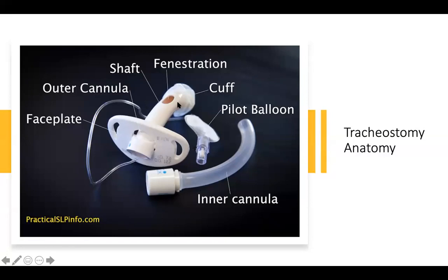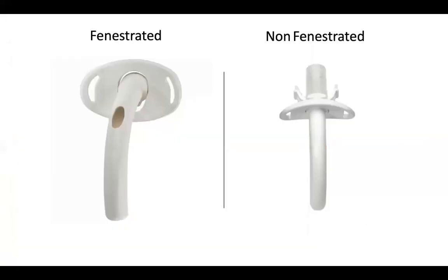And finally, this is a fenestration over here. I just want you, I mean, we're not going to talk about the different kinds of trachs out there, but I need you to pay attention to what fenestration means, because it's going to help us when we explain later on the use of the speaking valve.